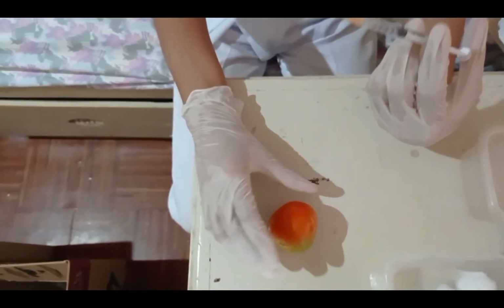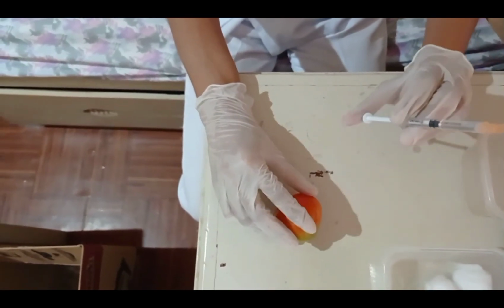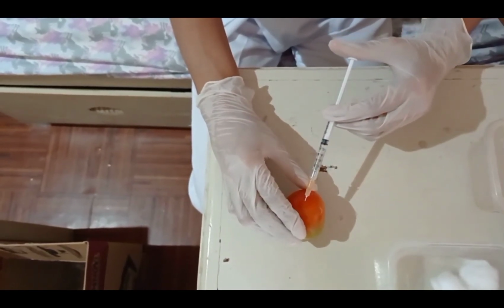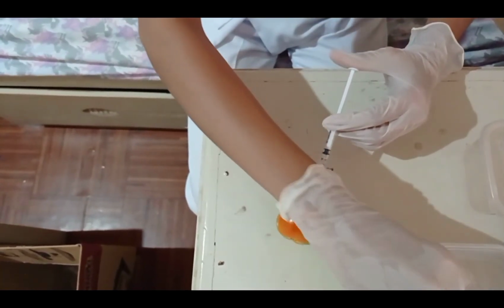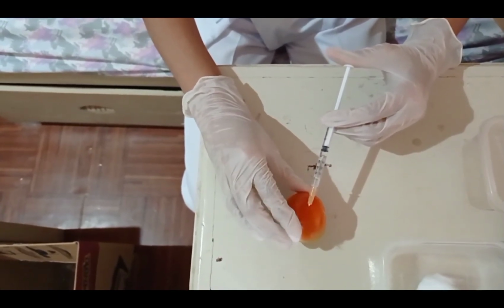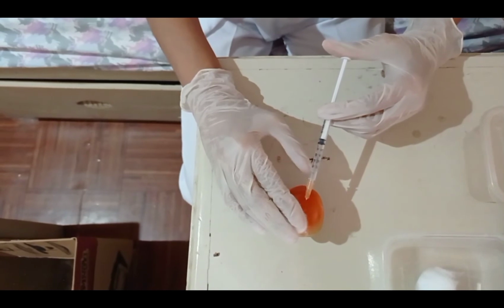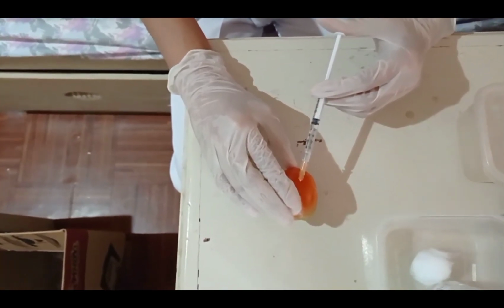We hold the syringe in the dominant hand between the thumb and the forefinger, then insert the needle quickly at a 45-degree angle. After the needle is in place, release the tissue. Move your non-dominant hand to steady the end of the needle. With your dominant hand, inject the medication at a rate of 5 seconds per 0.5 ml.